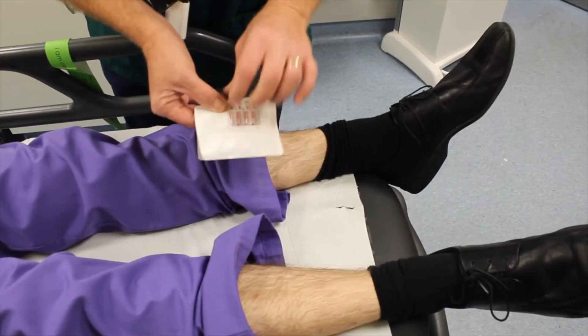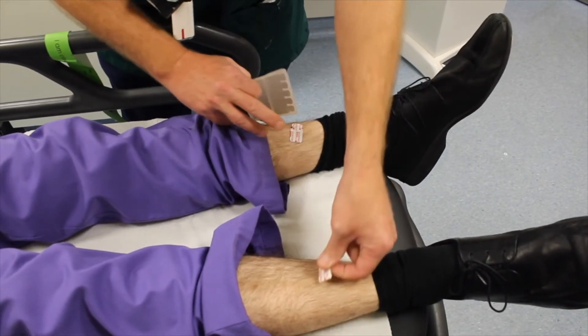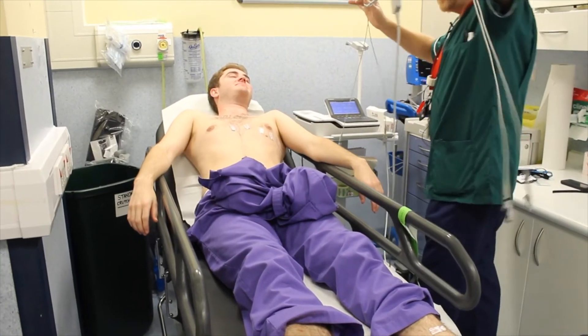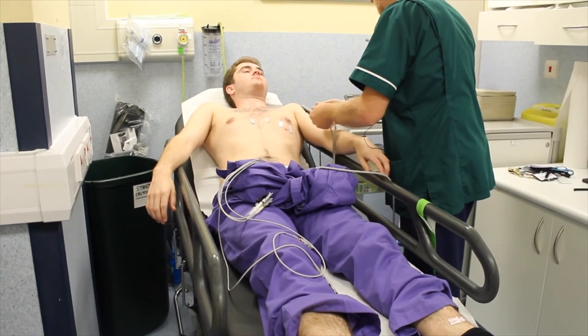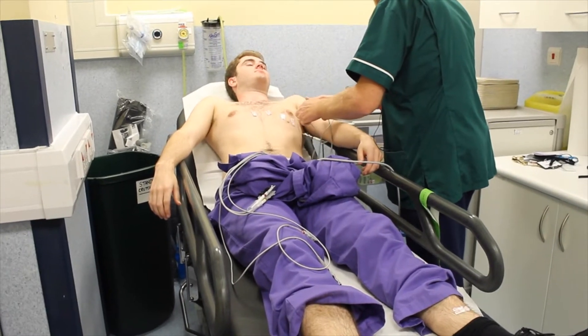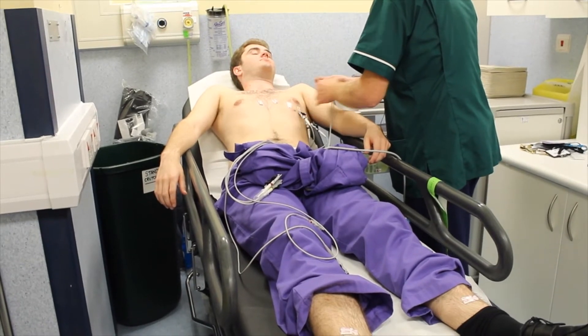Okay Jack, I'm going to connect these up now. Purple is number six, black is number five, brown is number four.